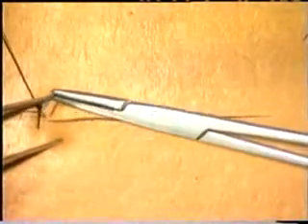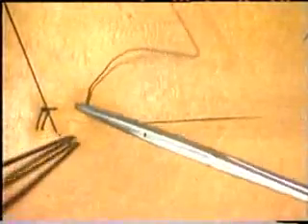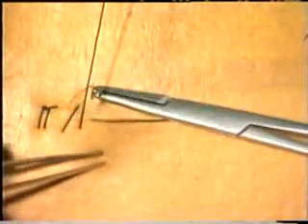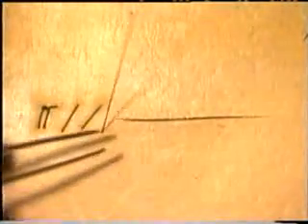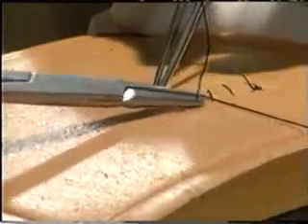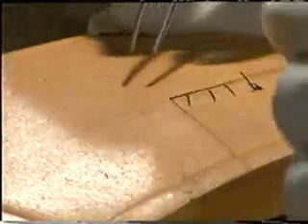The second suture is put in a standard manner as before, and then the suture snugged down and handed to your assistant. Here comes the third suture, the distance apart being exactly the same as for interrupted sutures. Work along the wound, each time ensuring the same tension, and then hand it to your assistant, who maintains that tension. Work along the wound, ensuring equal distance between the sutures to ensure the same tension down the whole length of the incision.